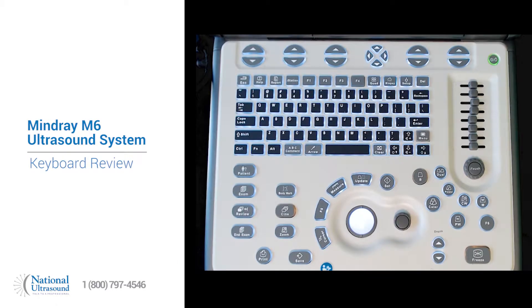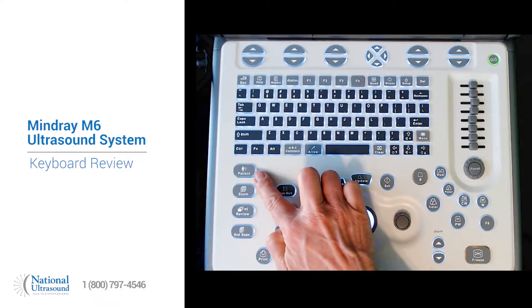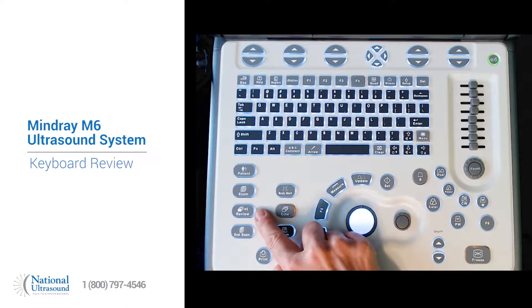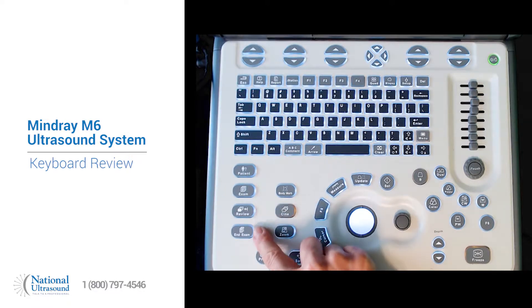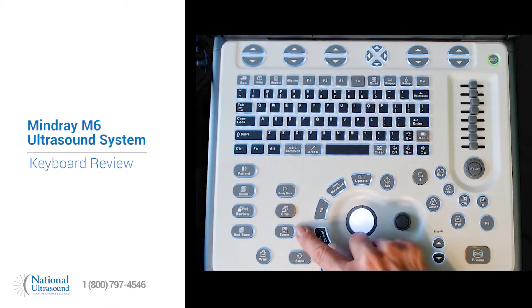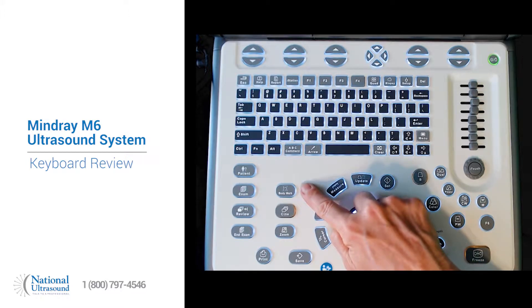This is the Mindray M6 ultrasound system. On the left side we see the patient button, the exam button to choose a preset, review which will review images during the current study and exam, print and save. These two buttons are programmable, zoom, cine, and bodymark.